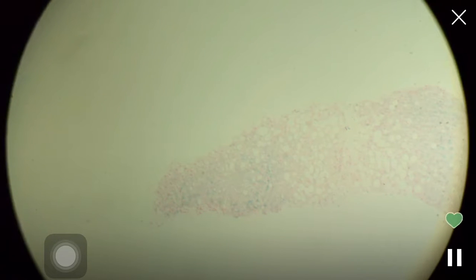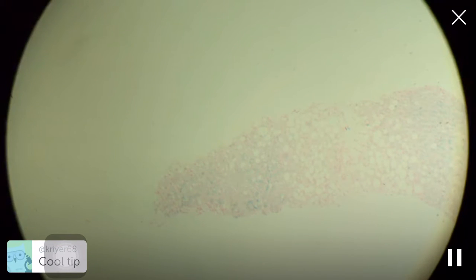The reason the iron accumulates in zone 1 near the portal tract is the first hepatocytes, you're talking about having a circulating overload of iron. That iron comes into the liver through the hepatic artery and the portal vein. The first hepatocytes that are going to see it and bind it and store it are those right at the portal tract. When they get filled, it's the next row of hepatocytes that are going to pick it up. And when they get filled, it's the next row of hepatocytes. So iron starts near the portal tract and extends outward. Fat starts near the central vein and extends back towards the portal tract. So when you have iron, it actually complements the fatty change in this biopsy.